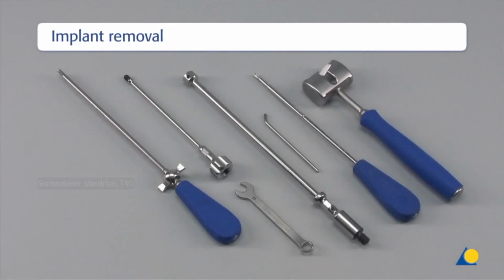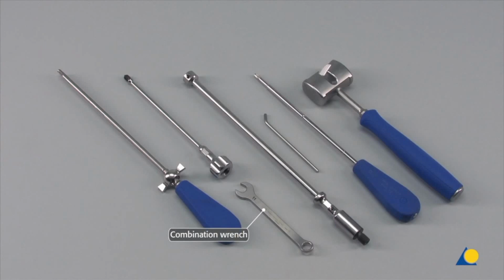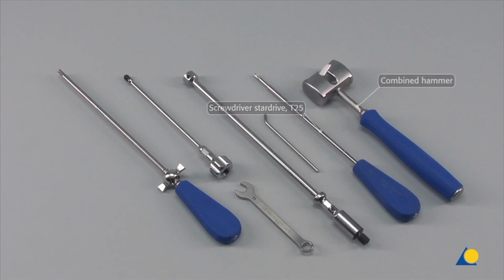The instruments for implant removal are the interlock screwdriver star drive T40, length 377 mm, the extraction screw for tibial and femoral nails, the combination wrench, diameter 11.0 mm, the hammer guide, the pin wrench, diameter 4.5 mm, the screwdriver star drive T25, self-holding, length 319 mm, and the combined hammer 500 grams.